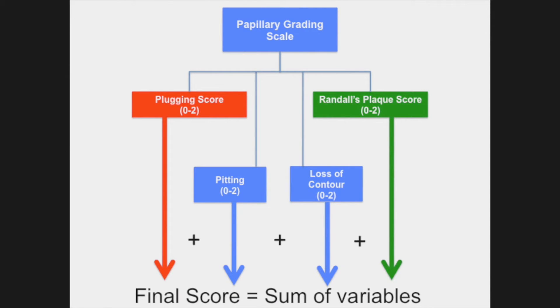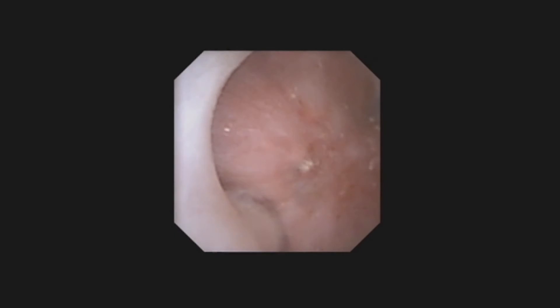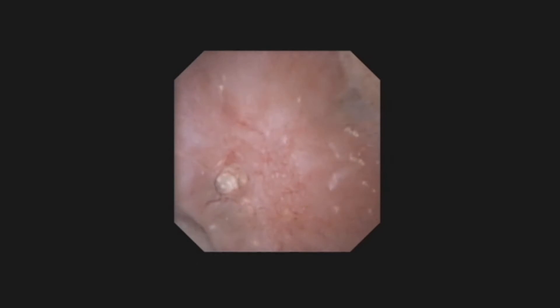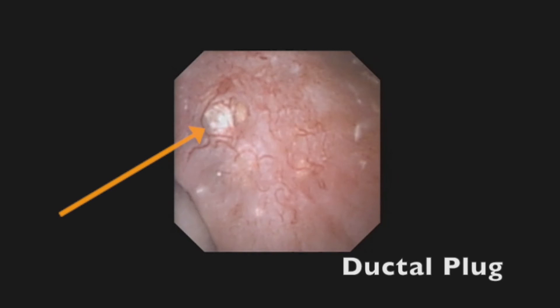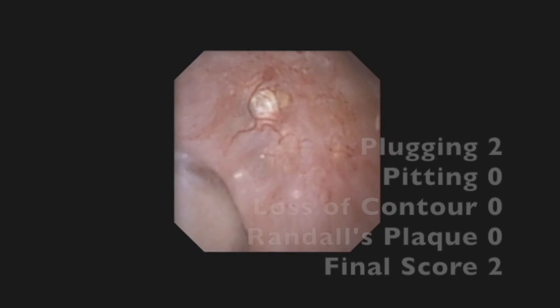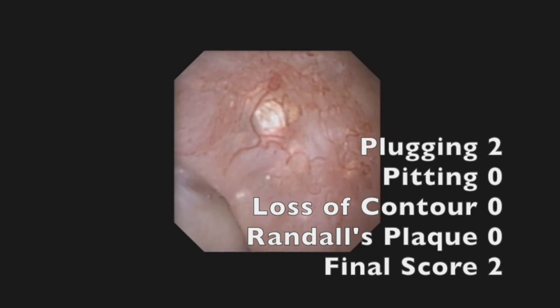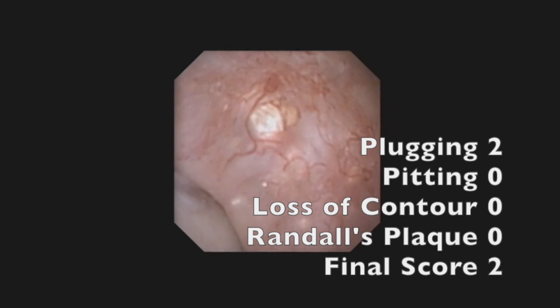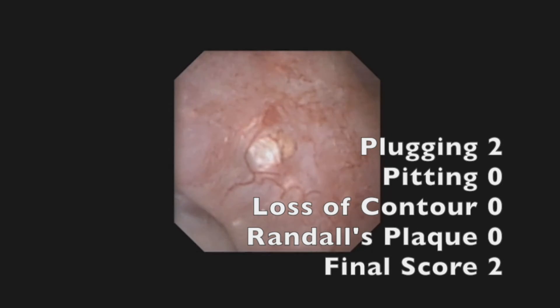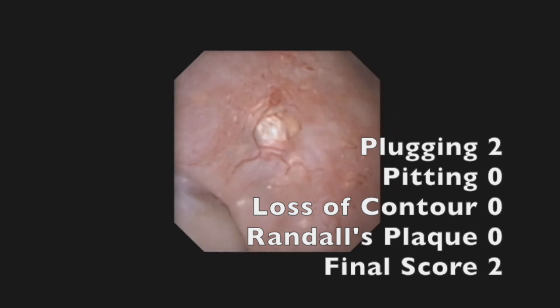At this point, the sum of the four measured variables is calculated, and a final papillary score is assigned for the individual papilla being studied. In this first reference example, greater than five yellow mineral deposits can be seen under the surface of the papilla — the largest of these is designated with an arrow. There is otherwise no pitting, normal contour, and minimal Randall's plaque. Final score is 2.